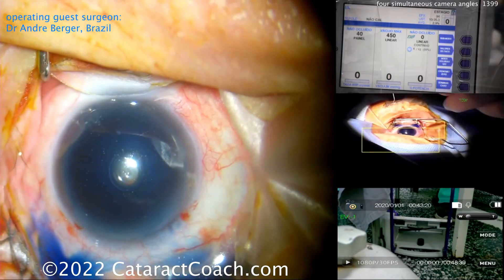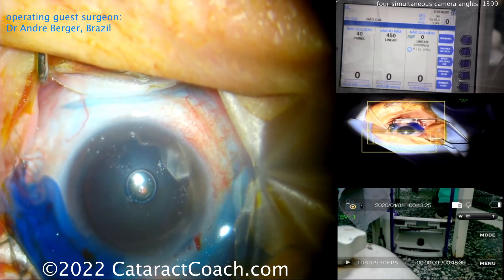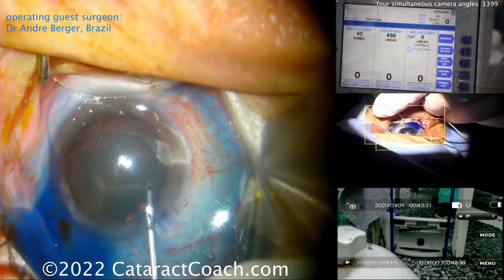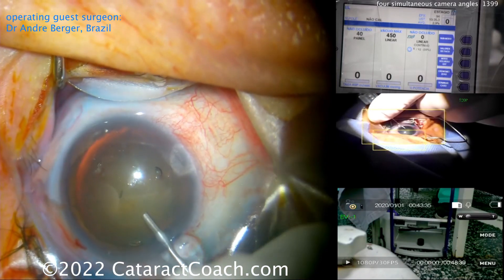Trypan blue dye went inside the eye. You can see the surgeon is sitting superiorly, and after the trypan here comes some viscoelastic — some sort of dispersive viscoelastic probably. There you go, and he'll get his rhexis done and get going.